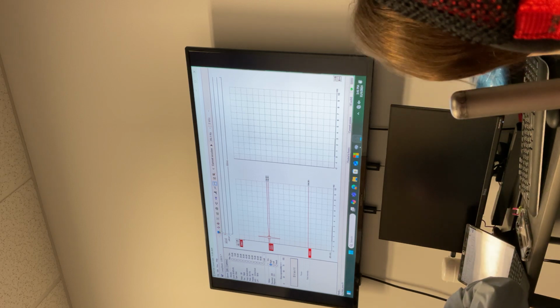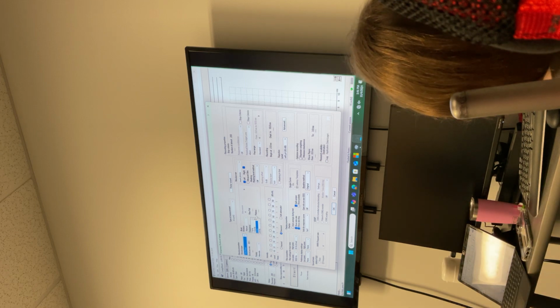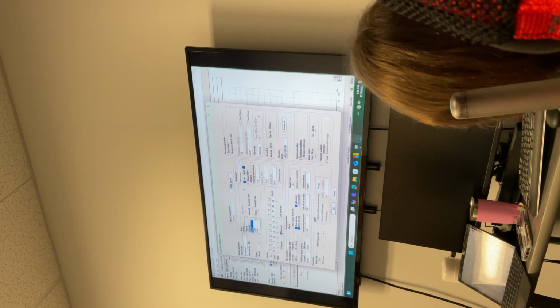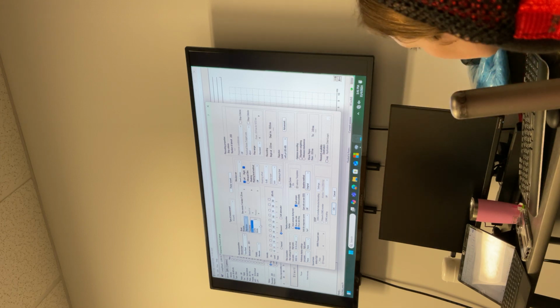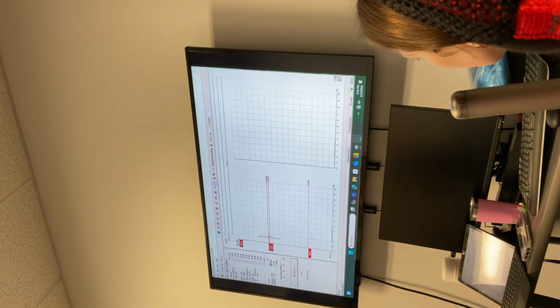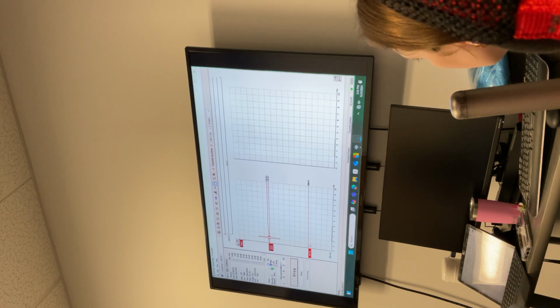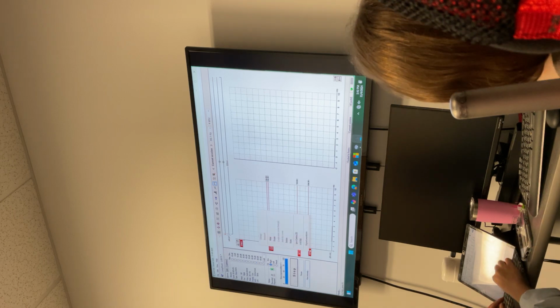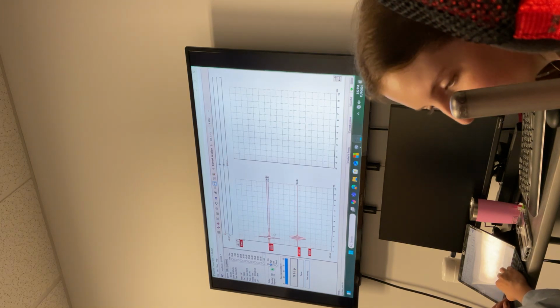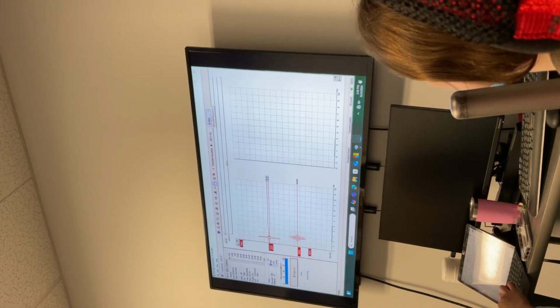So this is click. Now let's go to tone burst. Let's start with 4000 hertz. The window we're going to use is the Blackman. So we'll just choose one of the polarity, 80 dB. So this is 4000 hertz, for tone burst.